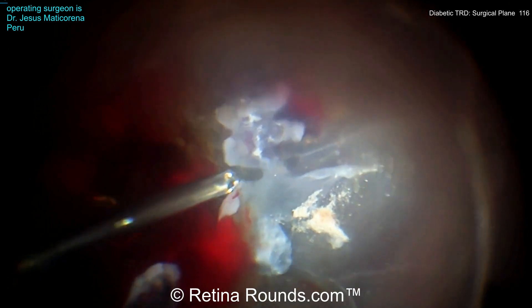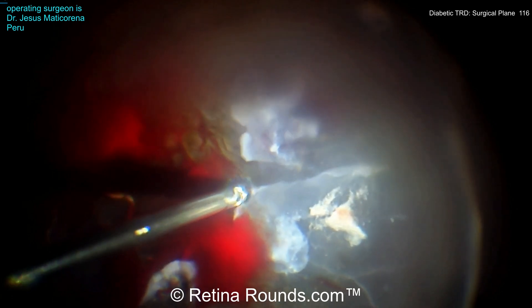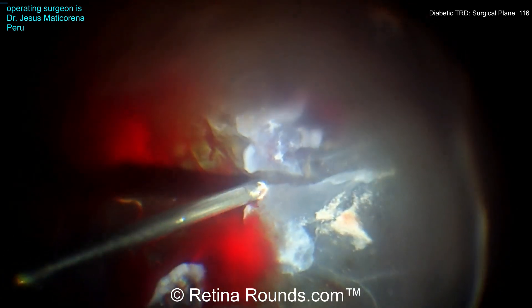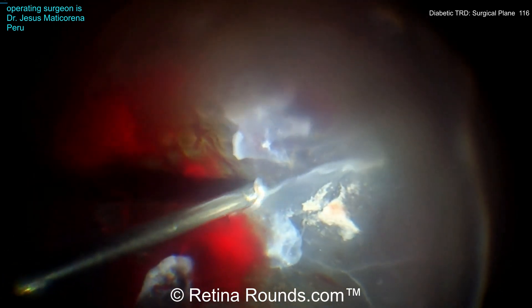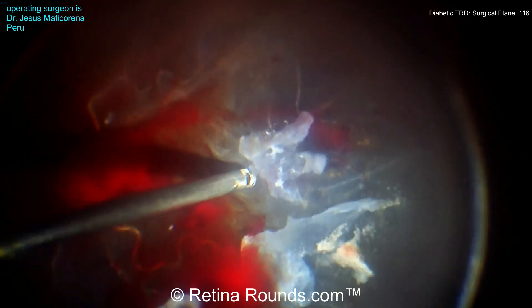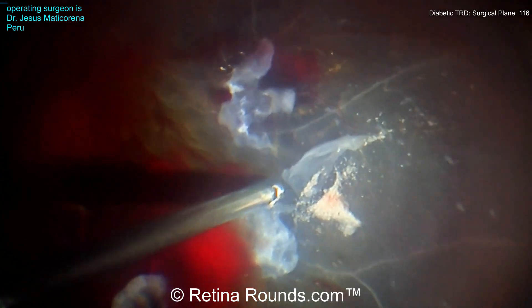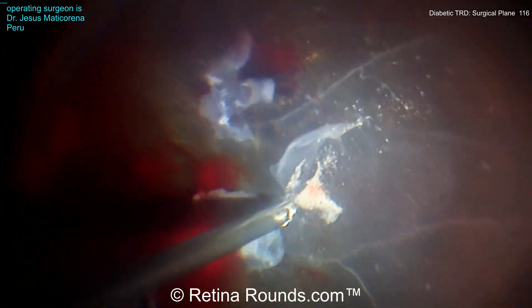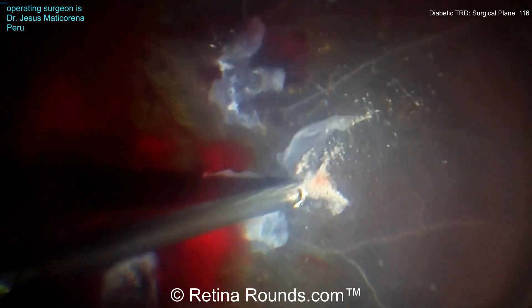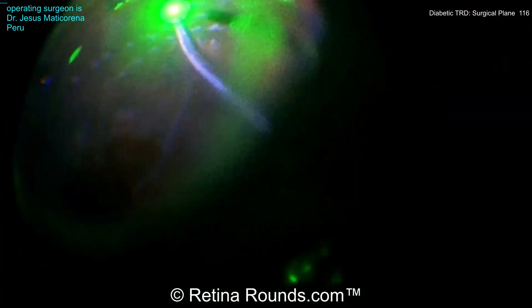Going back to a temporal area of fibrosis, there are some areas that appear pretty adherent. The retina looks to be pretty detached, and when there's this amount of subretinal fluid, one can be concerned about the presence of a small micro break. It's important to clear off the hemorrhage to make sure there are no small breaks contributing to a potentially combined tractional and rhegmatogenous retinal detachment.